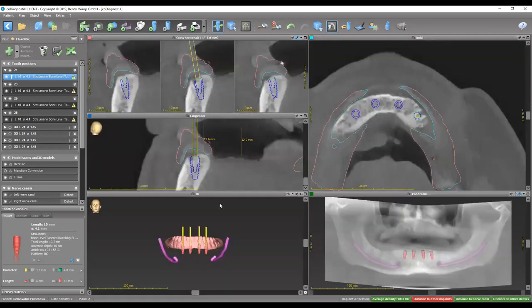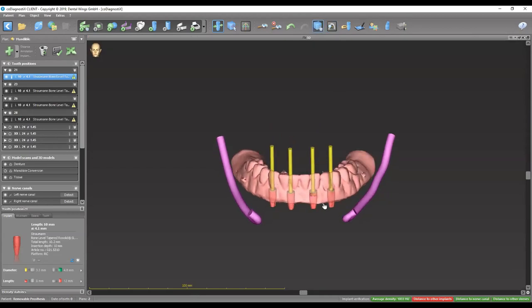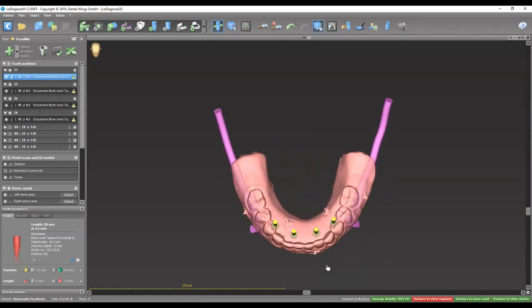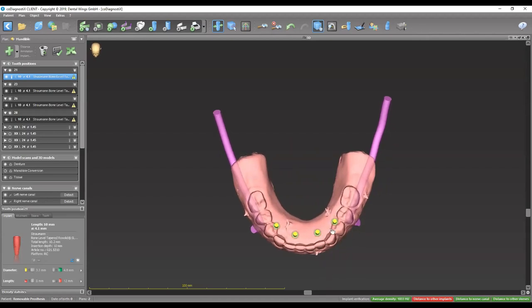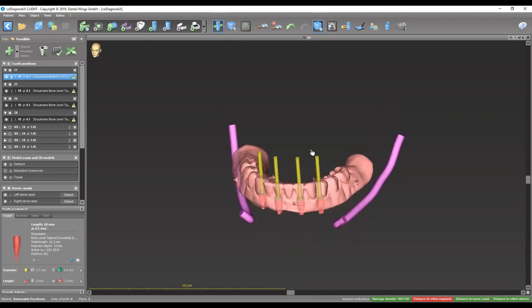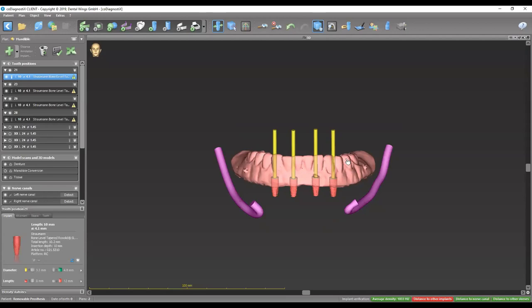We've made sure all four implants look good in the bone. Looking at the occlusal view, we could still push the implants a bit more distal, but I don't want them too close to the anterior loop — even though they're 10 millimeters long, I want to make sure they're more than two or three millimeters away from the loop. For an overdenture, you don't need that much AP spread — four implants will do the job and retain the denture in position.